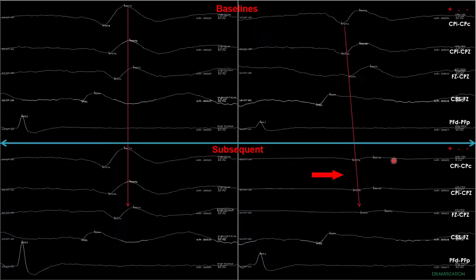It's kind of a conundrum when it's a spine case, because you don't expect to see unilateral cortical changes. I've seen it a couple of times during my reign as spine queen for over 20 years. In both of those times, they've had a stroke during the case. So this is something that needs to be paid attention to. Chances are the patient's vitals are unstable at this point as well. I know in the cases that I've seen, the blood pressure was unstable.